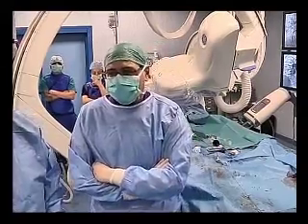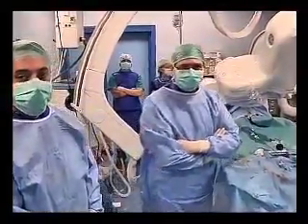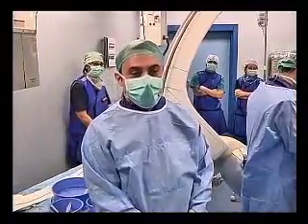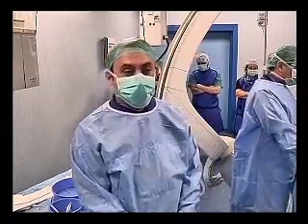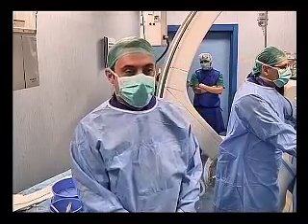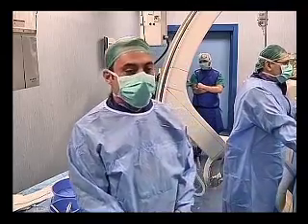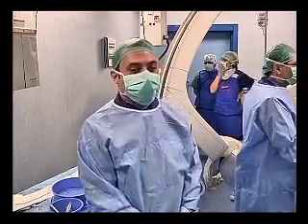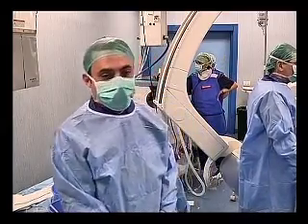The case, live case, and Giampiero will summarize the data of the patient. Okay, it's a 5 years old child, 19 kilograms, with a late diagnosis of absent left pulmonary artery and ventricular septal defect. That at 3 months of life underwent catheterization, in which we showed a patent ductus arteriosus connected to the left pulmonary artery.